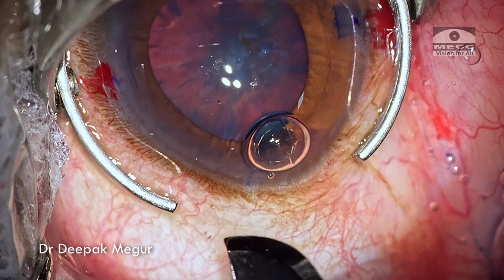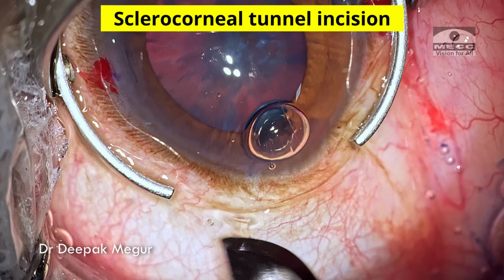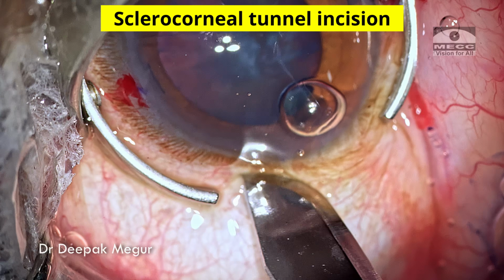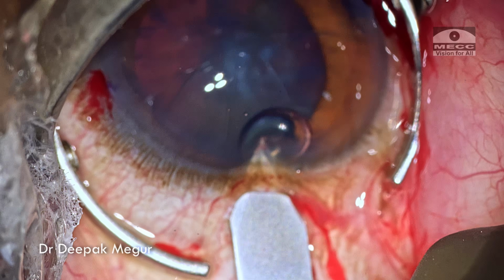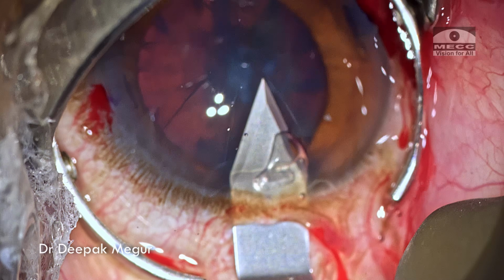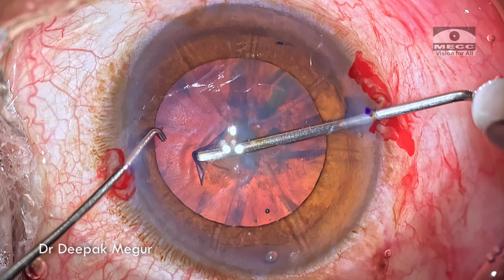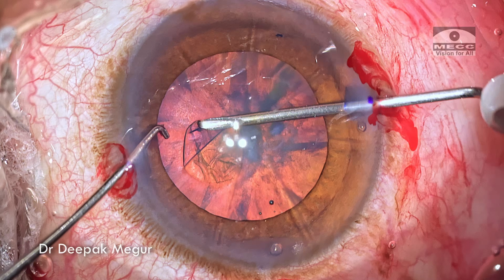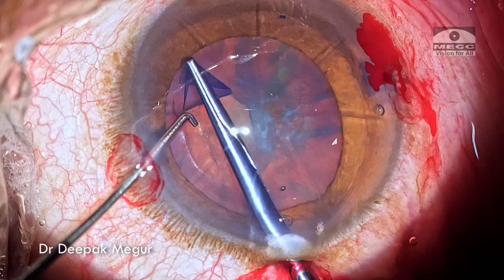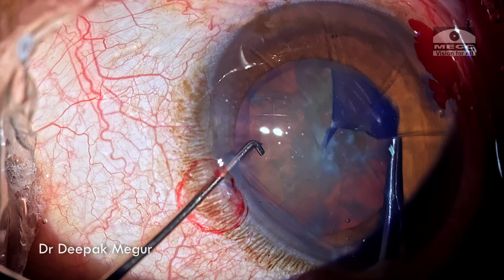In eyes who have undergone radial keratotomy, my preference is always to perform a sclerocorneal tunnel in between two cuts. I have created a scleral groove, and then using a 2.8 mm keratome, I am going to create a sclerocorneal tunnel entry into the anterior chamber. The capsule is punctured with a bent 26 number needle, and then using Rhexis forceps, the flap is held and the Rhexis tear is initiated.